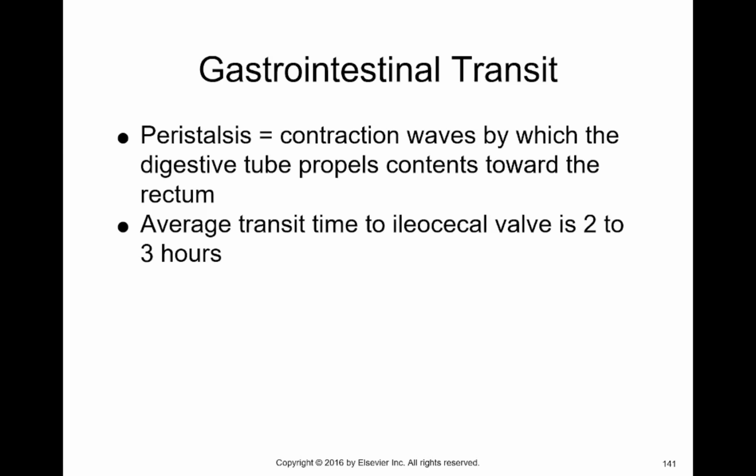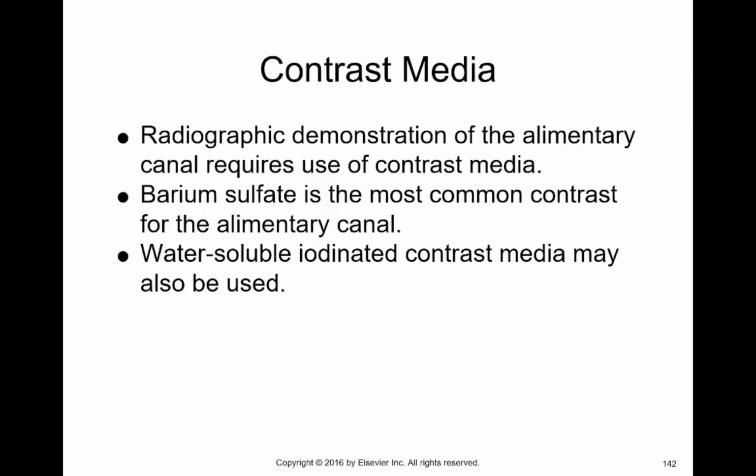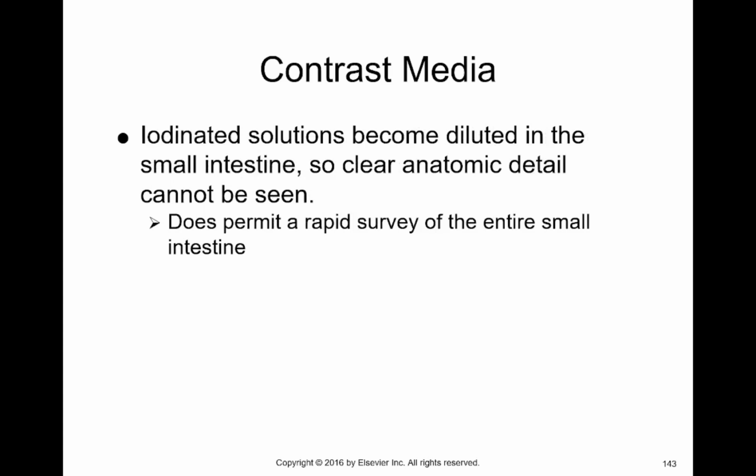Peristalsis, again, is just like in the esophagus, it's contraction waves. So contrast media, we've kind of done that to death, so I'm not going to stop on that. The iodinated contrast, just make sure you understand two things. One is if the patient is most likely going to surgery, iodinated contrast is the contrast you want to use, unless specifically ordered otherwise.